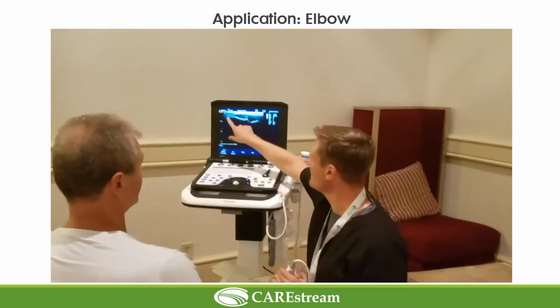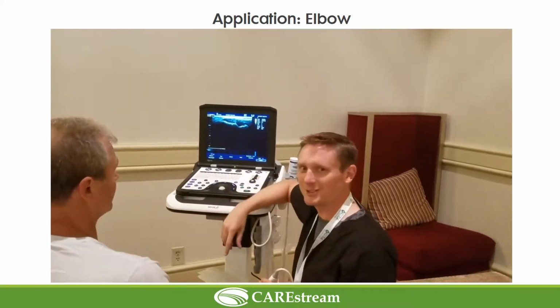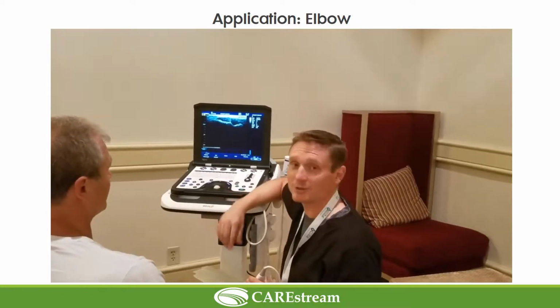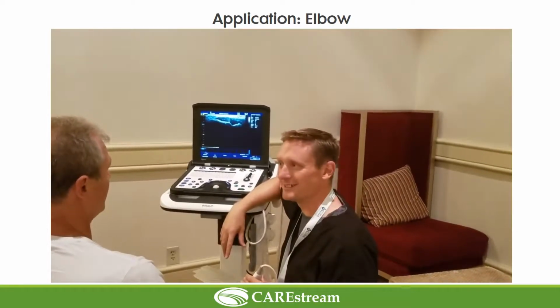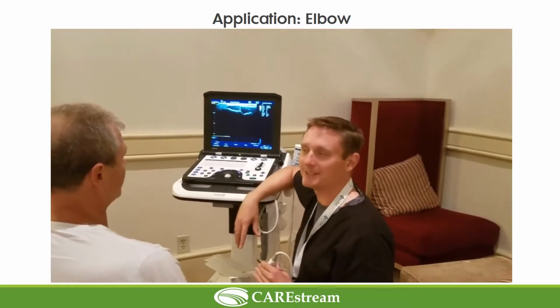We look at our symptomatic patient, he's at 0.5. He's 1 millimeter larger than ideal. This tells us that he has a tendinosis of the common extensor tendon. And we've just verified that he has a symptomatic lateral epicondylitis.